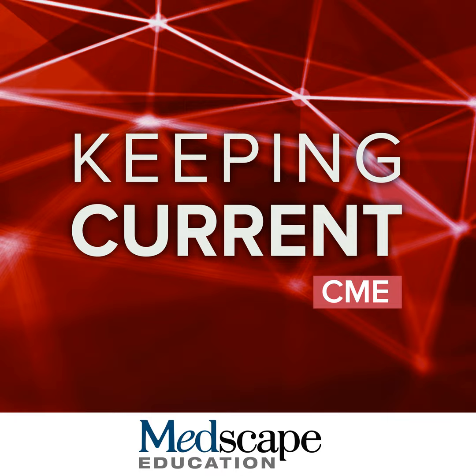All right, so tau PET was also used in the Trailblazer study to stratify the patients at the study entry. They were looking for patients who had early impairment, but also really found that people with that low intermediate tau pathology were the ones who responded best to the treatments, which makes sense.